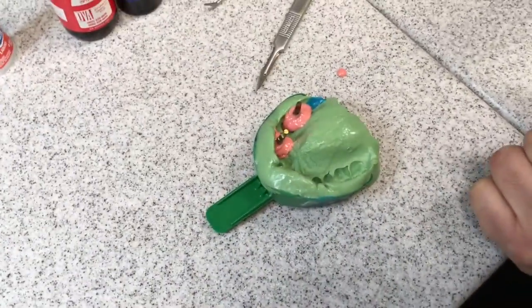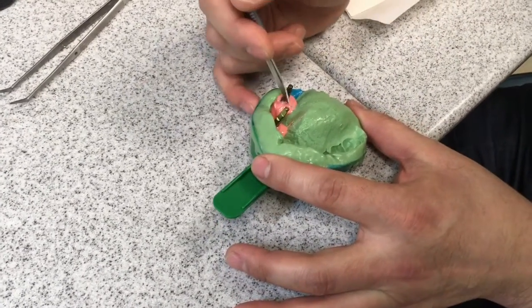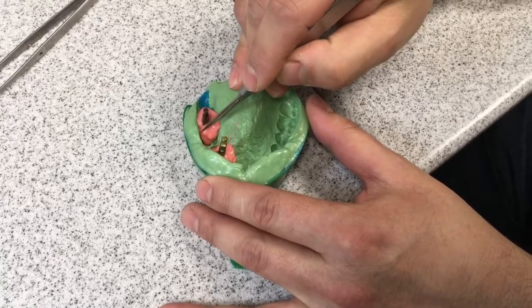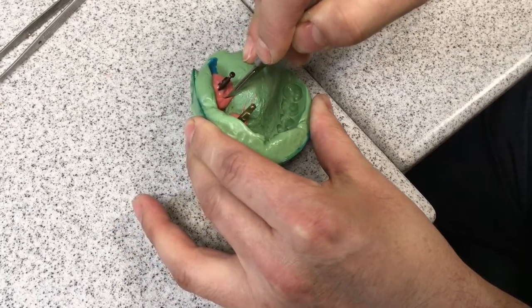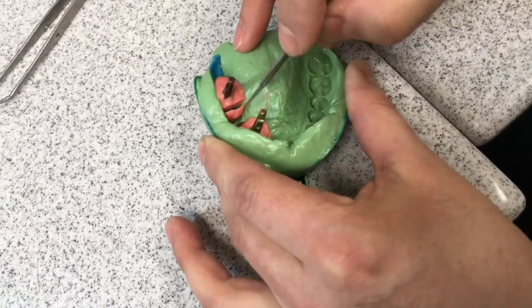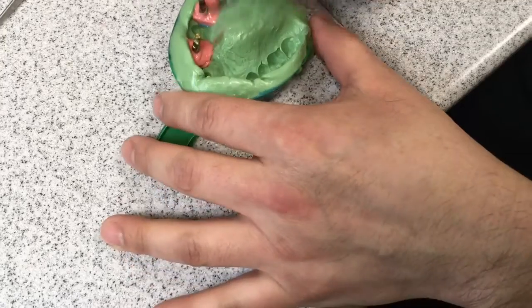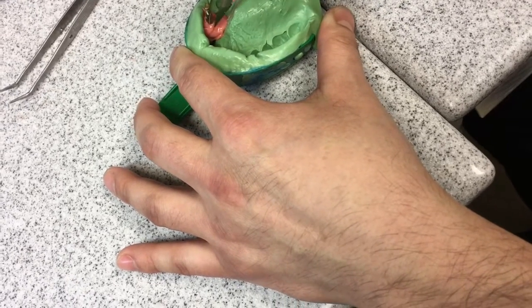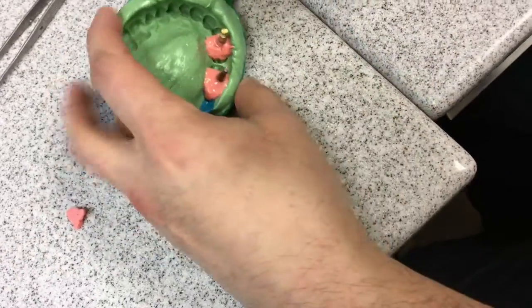Now we're gonna let that set and remove it. I'm gonna trim approximately right between the implant and the tooth — I'm eyeballing this — and I'm pushing all the way down and basically stabbing the impression to get a nice clean cut. Perfect. We'll do the same thing on this one — guessing and cutting, pretty close.